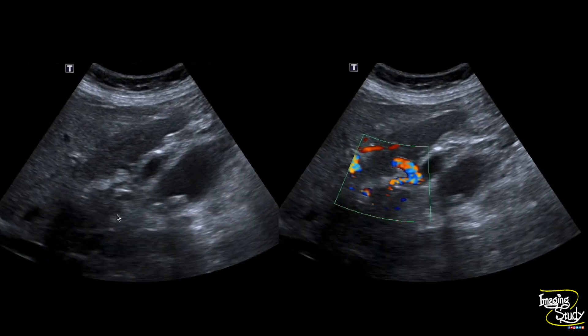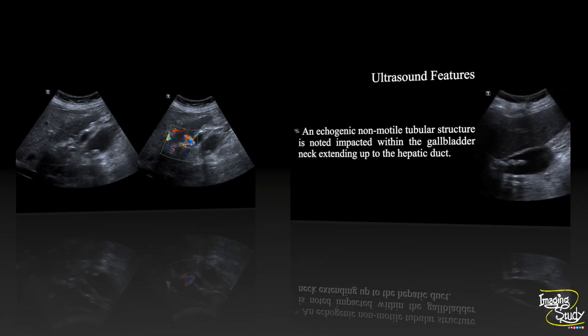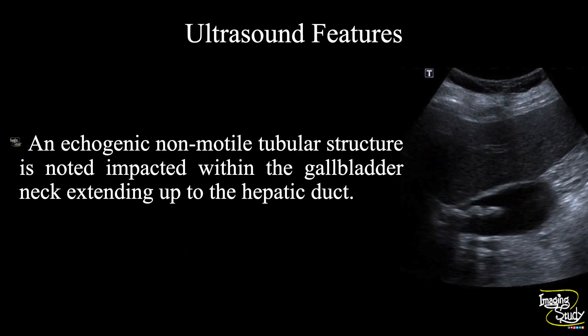On this image you can see this extends up to the hepatic duct level with surrounding edematous changes due to inflammation, which you can appreciate by looking at the surrounding increased vascularity. In summary, an echogenic non-motile tubular structure is noted, impacted within the gallbladder neck extending up to the hepatic duct, indicating this as a case of biliary ascaris.